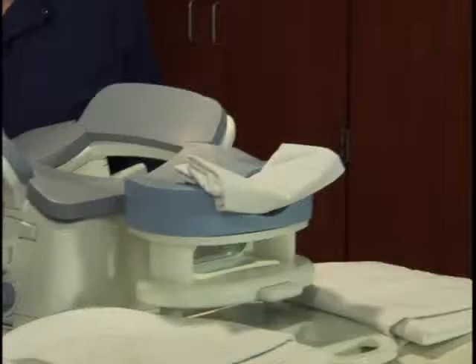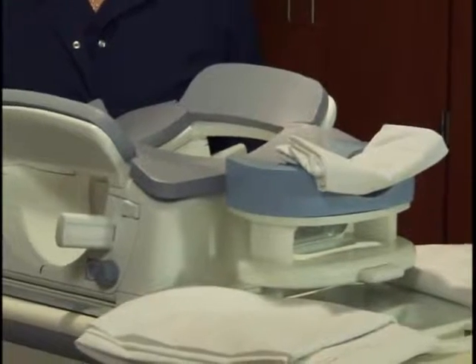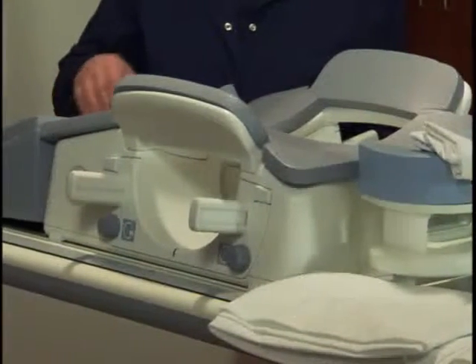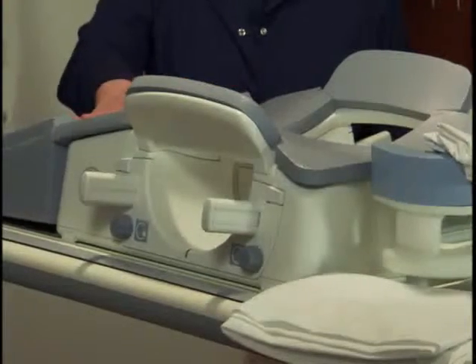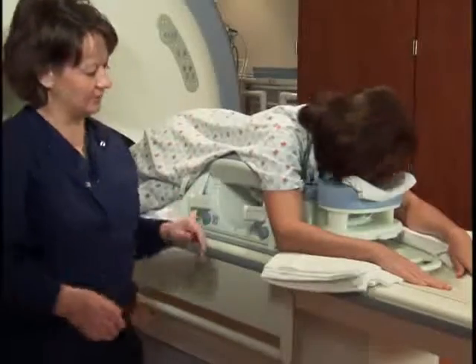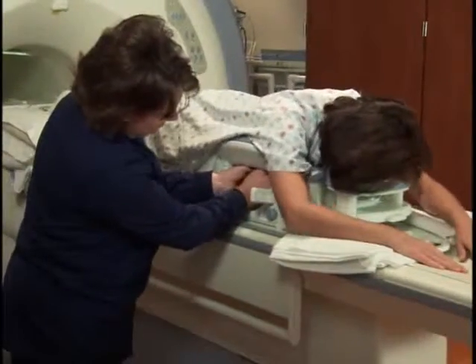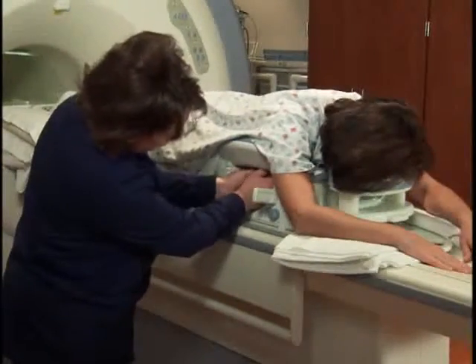The eight-channel coil comes equipped with medial and lateral plates, which are used for interventional purposes and to help immobilize the breast due to motion artifacts caused by the gradient vibration. With the medial plates in place only, the patient's exposed breasts are placed in the center of each coil. You should then gently pull on each breast to ensure all the breast tissue is in the coil and not tucked under the patient.